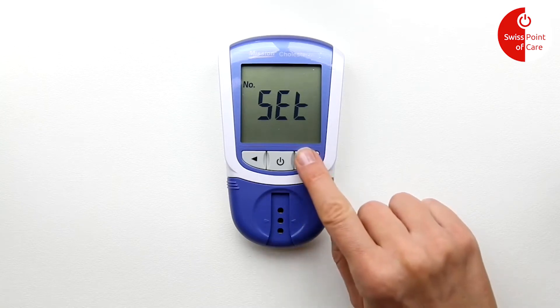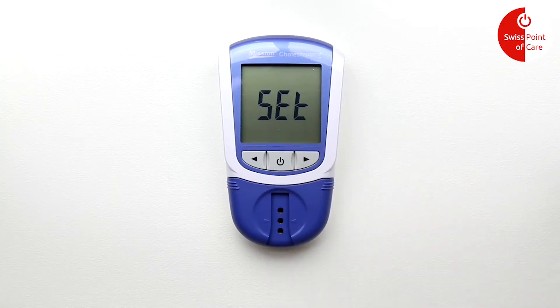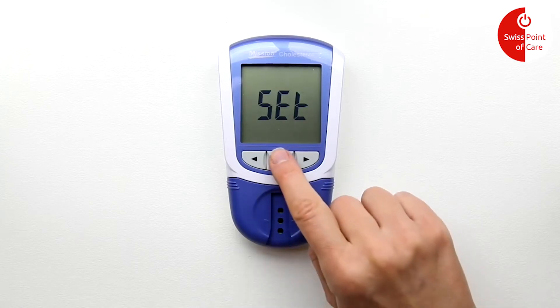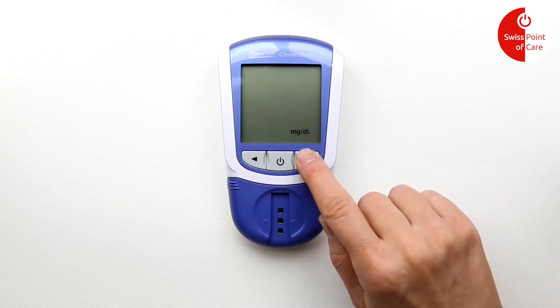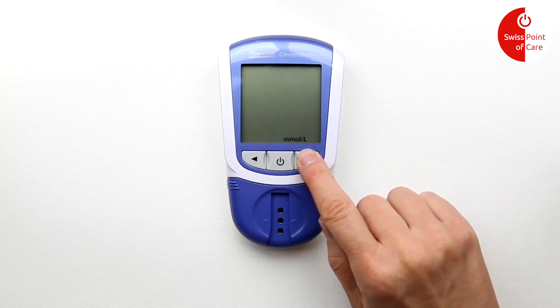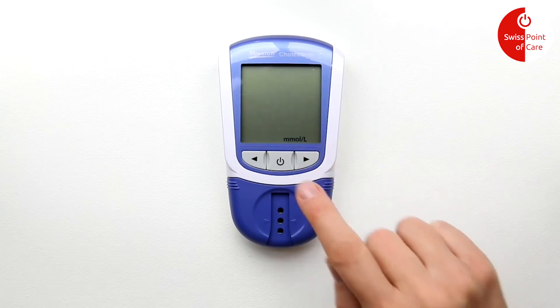Press the right button twice to navigate to 'set' and press the on/off button to set the meter. Use the arrows to toggle between mmol and mg/dL, and use the on/off button to confirm the selection.